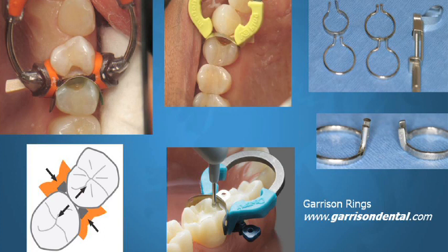What ring system you use is really your choice. The newer ring systems have wider tines, and that allows us to use them in situations where your proximal contacts are really wide. So I'm a little partial to the Garrison ring because of the softer tines.